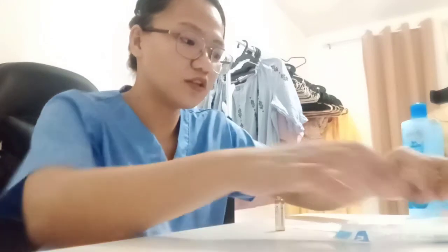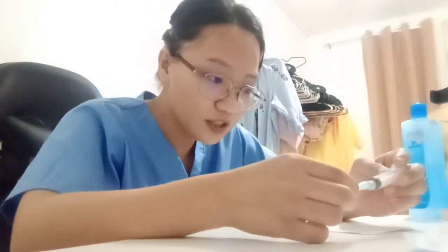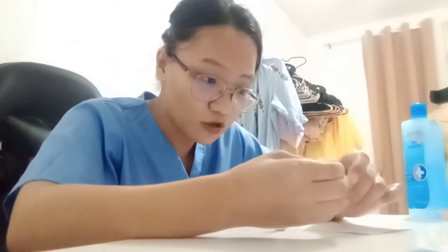Next is the withdrawing of the medication. In withdrawing the medication, place the ampule on a flat countertop or flat surface. Next is to attach the filter needle to the syringe. Since we don't have a filter needle, let's just assume that this one here is a filter needle or filter straw. Next is to remove the cap of the filter needle and put the needle in the center of the ampule. Do not touch the rim of the needle.